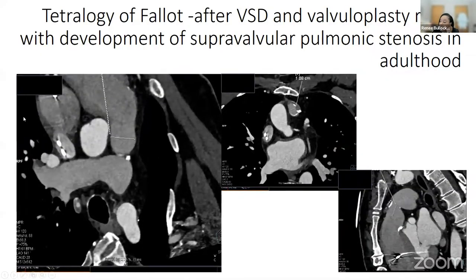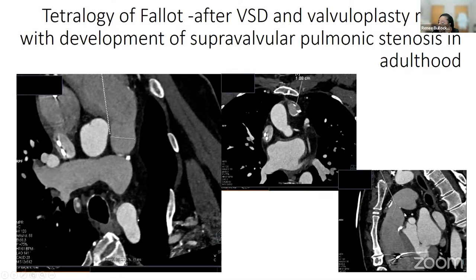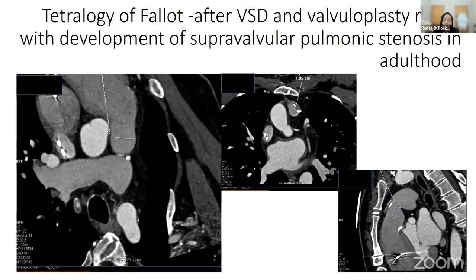Here is another tetralogy of Fallot patient who developed supravalvular stenosis — very tight stenosis as seen in the cross-sectional views. This patient presented with syncope and had to be referred for placement of a pulmonary valve conduit to relieve the stenosis.